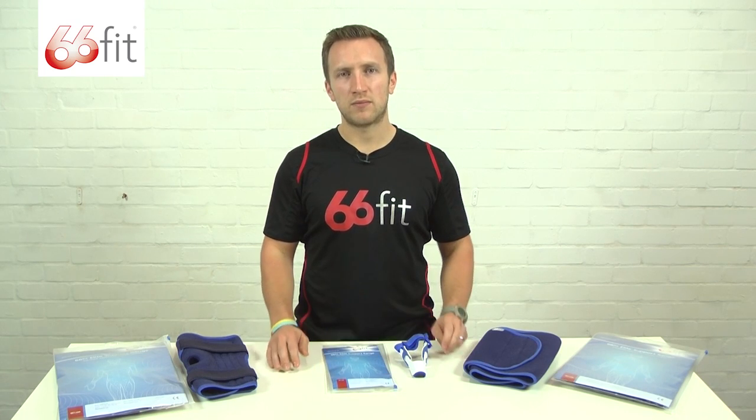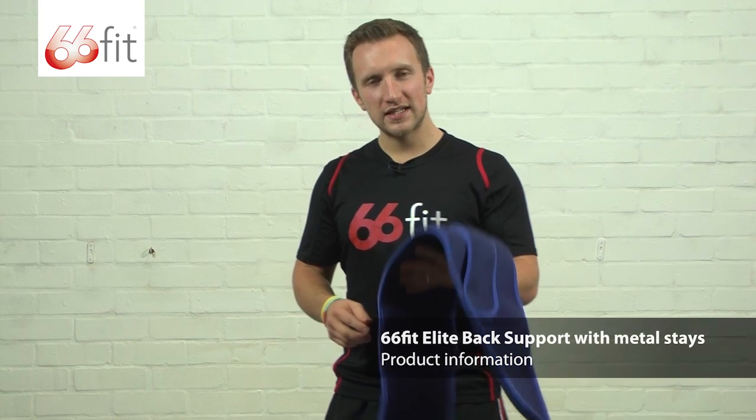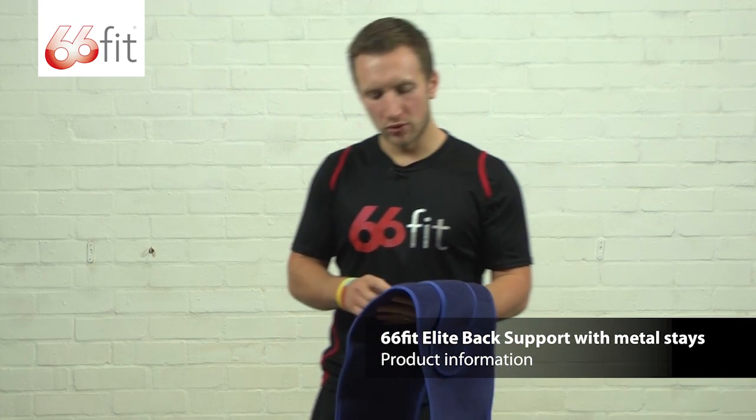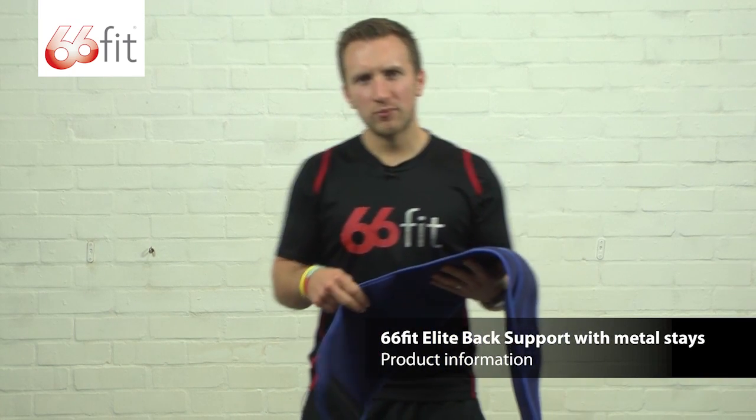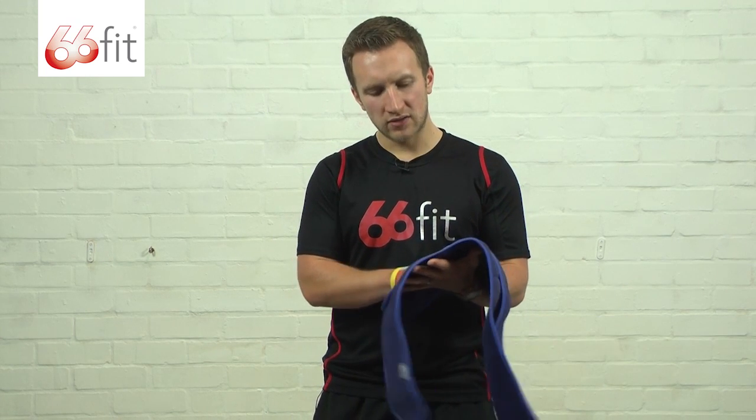I'm now going to show you in a bit more depth one of those supports. This is the 66 Fit Elite back support with metal stays. It's made from a 100% breathable neoprene inner core and 100% nylon outer layer.